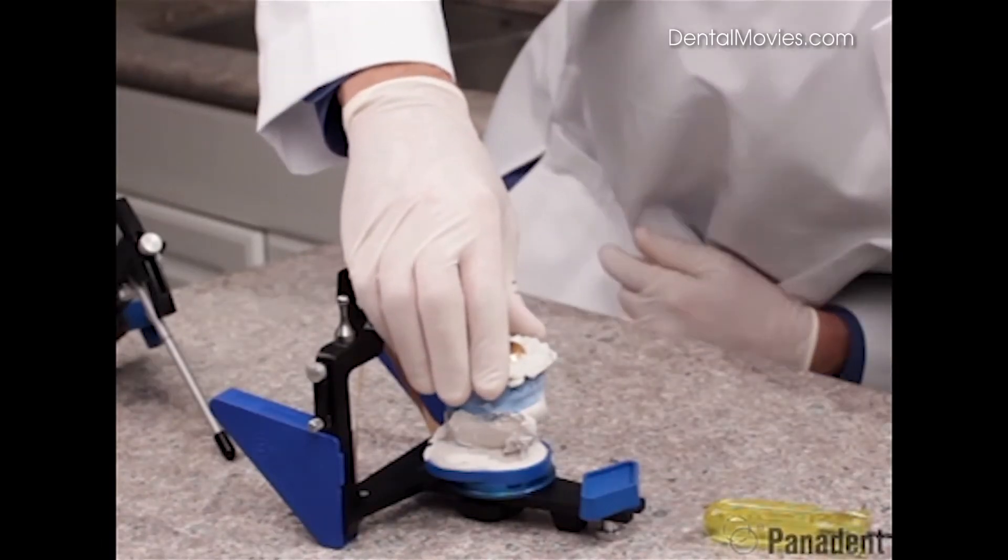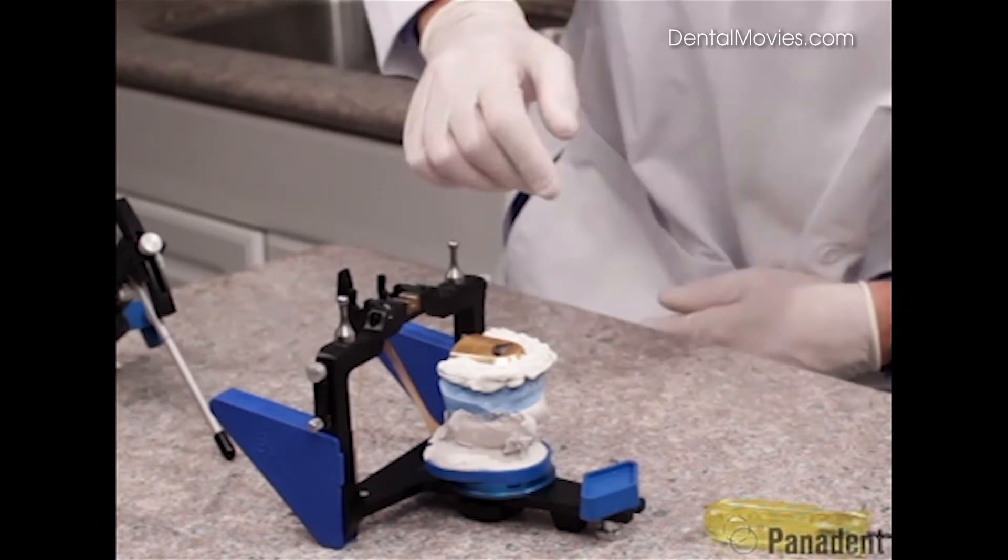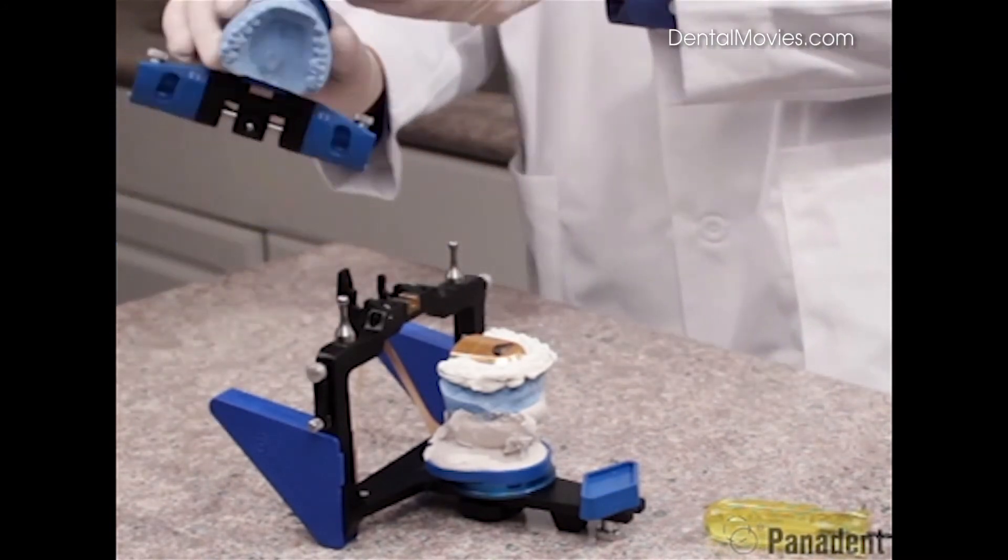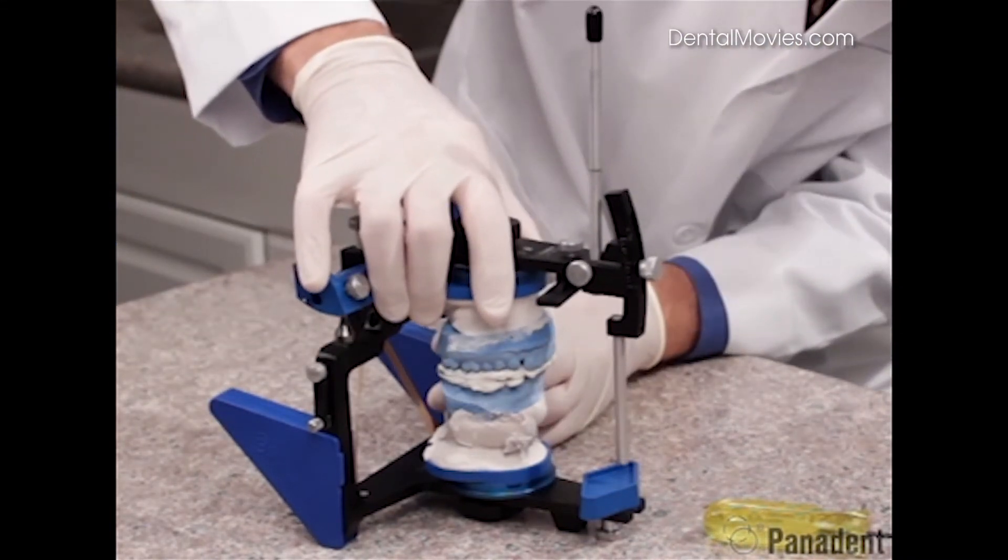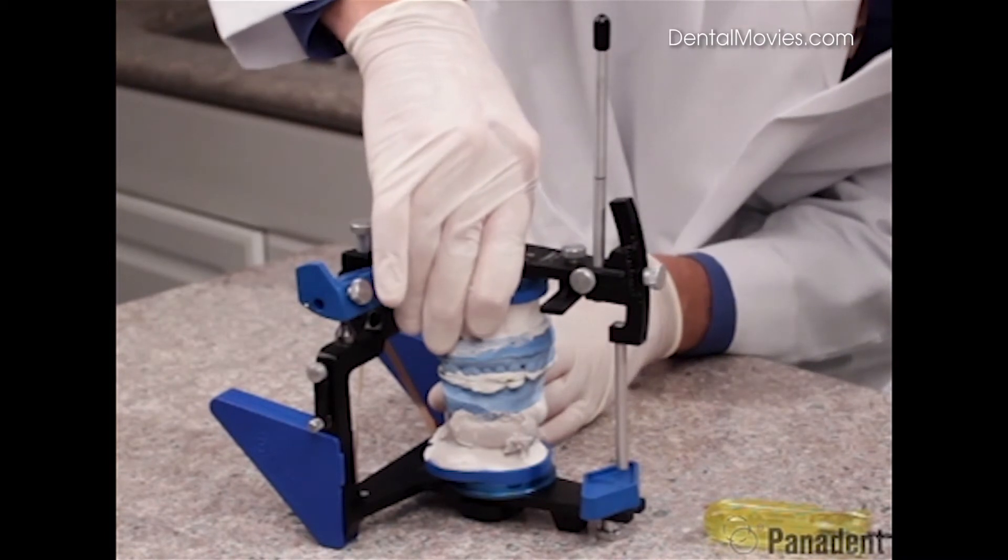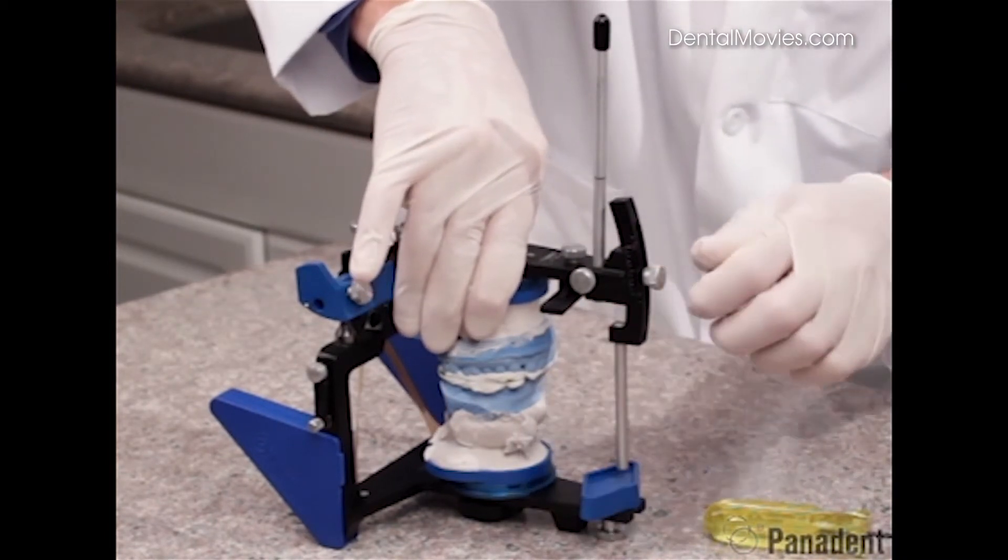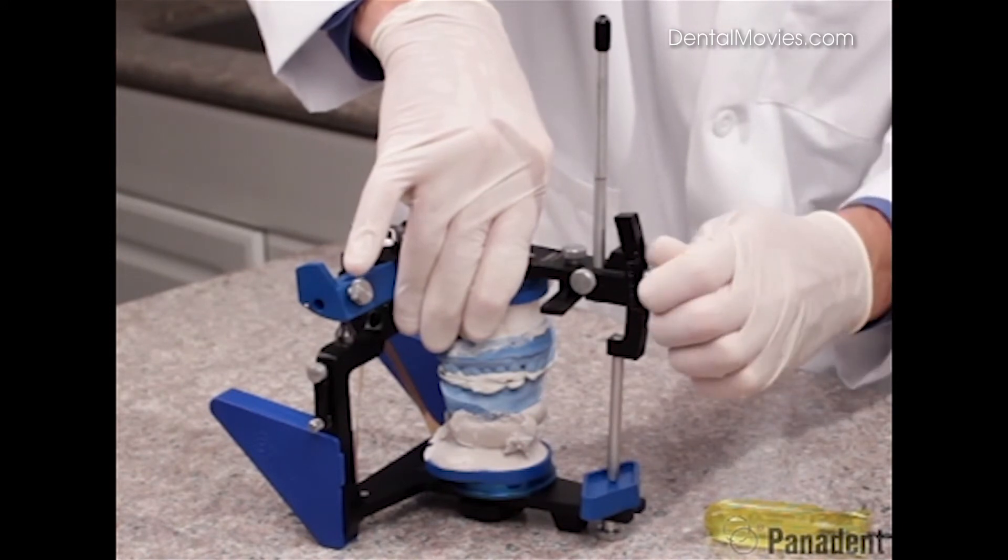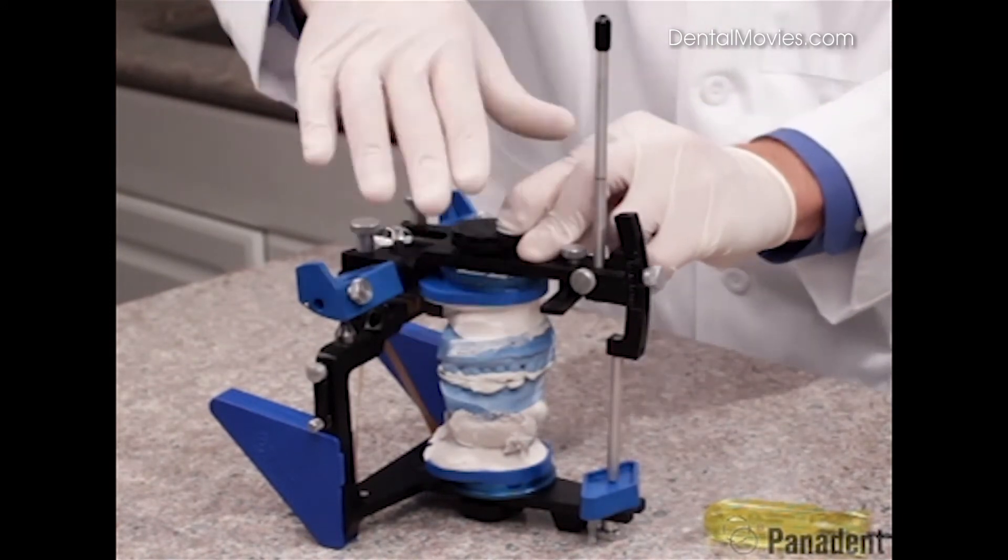So we now set our protrusive check bite into our lower cast. And then we can bring our upper frame around and set our upper cast into the protrusive check bite and push firmly down in the center here. And then we can loosen the incisal pin, dropping that down to create a bigger tripod for better stabilization.